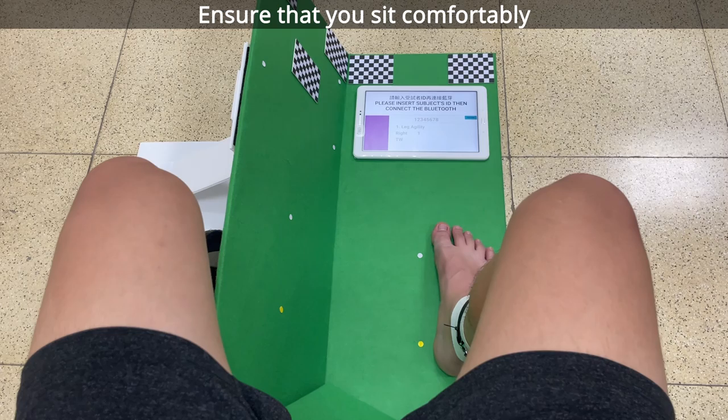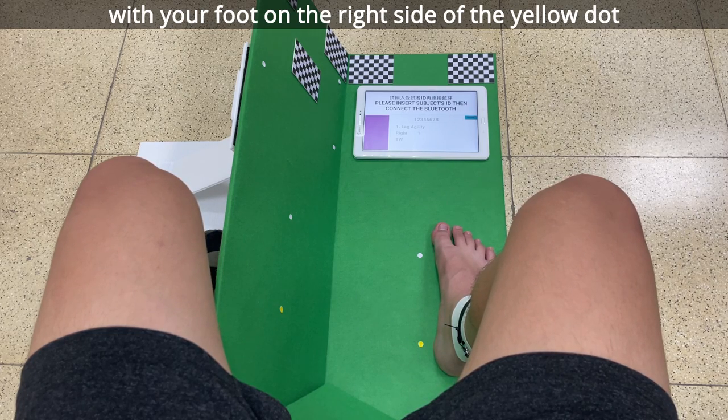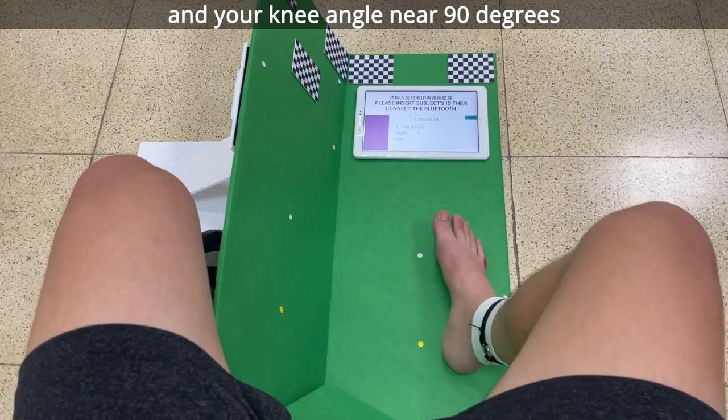Ensure that you sit comfortably with your foot on the right side of the yellow dot and your knee angle near 90 degrees.